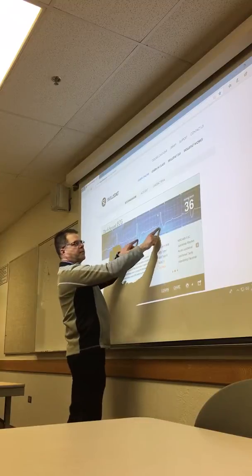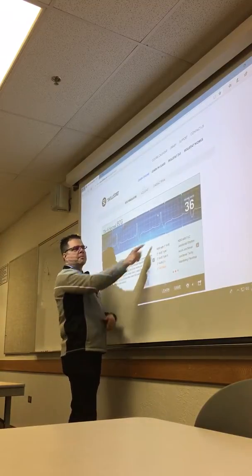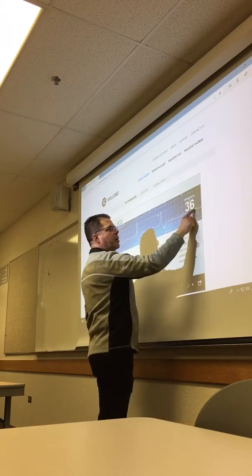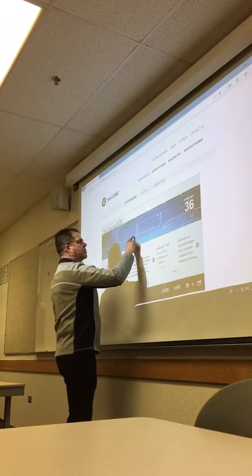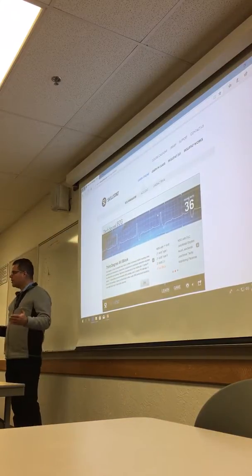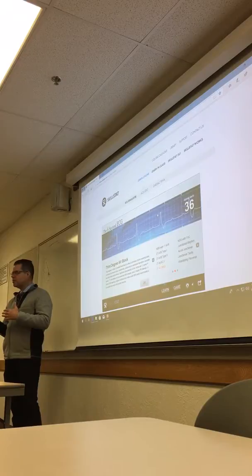Now, do you guys see the difference here with how that signature looks on the rest of these? This means I have a P wave in there. And here we go with this one. So I have a rate of 1, 2, 3, 4, 5, 6, 7, 8, 9, 10, 11. I have almost 110 atrial beats in this strip. But how many ventricular beats do I have? So this is the equivalent of the atrial rate being at 4/4 time and the ventricular rate being at 3/4, and having different music overlapped on top of one another.